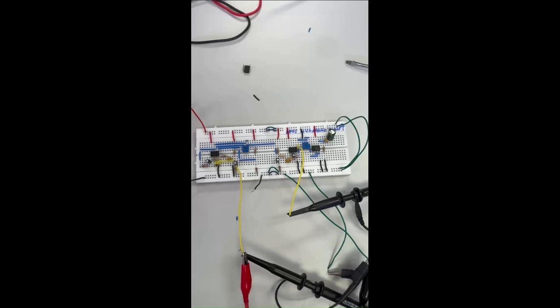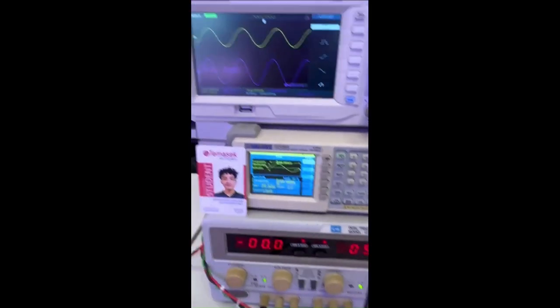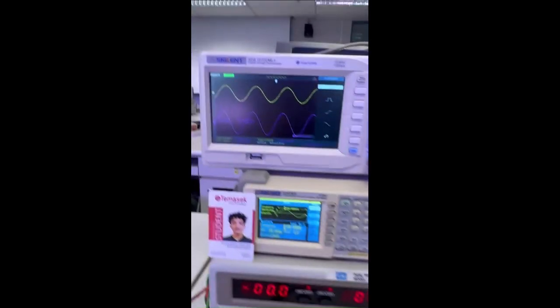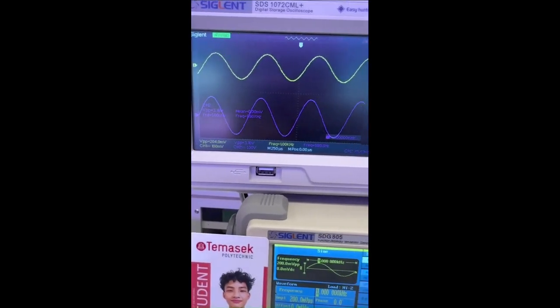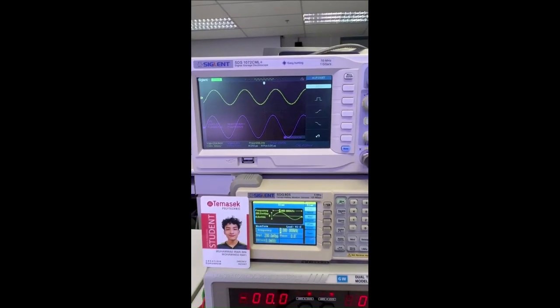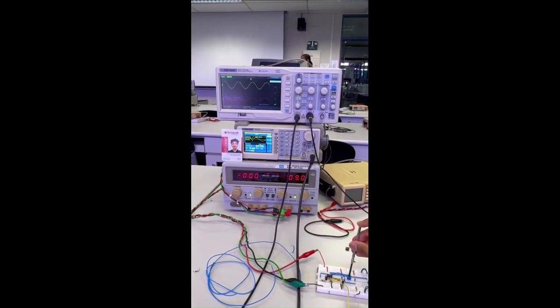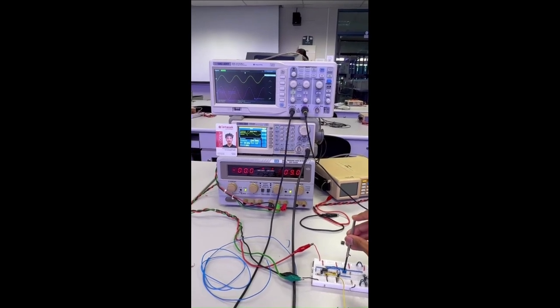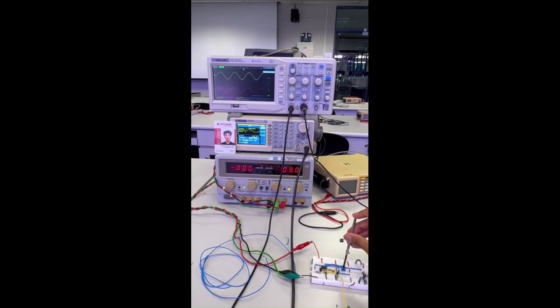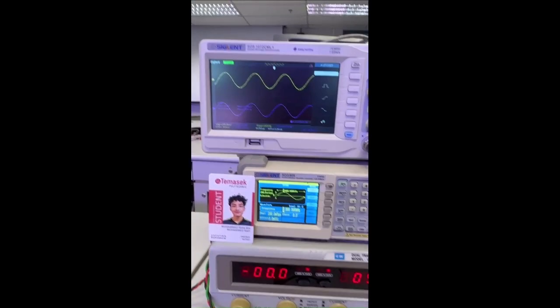This is me measuring TP4, the output of block 3. So as you can see here, the sine wave labeled at the oscilloscope has a voltage peak to peak of 3.16 volts at 1 kHz. And since stage 2 is directly connected to stage 3, the trimmer potentiometer from stage 2 would affect the output at TP4 as well, as you can see here when I was adjusting the trimmer potentiometer.